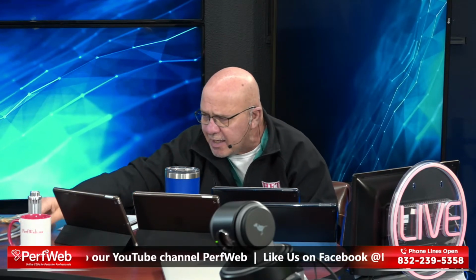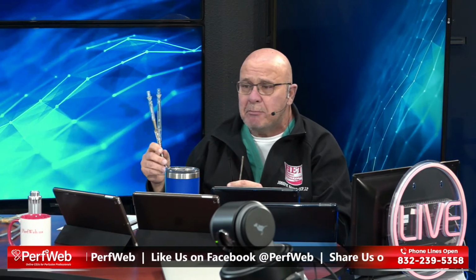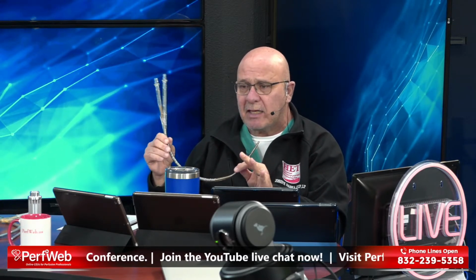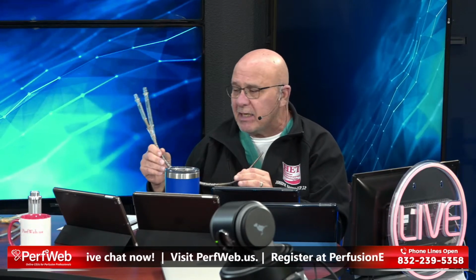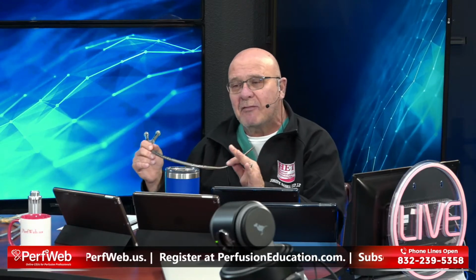And then, of course, for right heart dysfunction and also for VV ECMO, this is used by a lot of people for just VV ECMO, notwithstanding RV dysfunction. And certainly, anytime you do VV ECMO, it is possible to get RV dysfunction, RV failure. We've seen that happen several times. This would certainly, I think, help to mitigate that, or if it didn't mitigate it, you're already treating it. But it has some disadvantages in that, in my experience, you can't get as much flow. However, you have almost no recirculation.